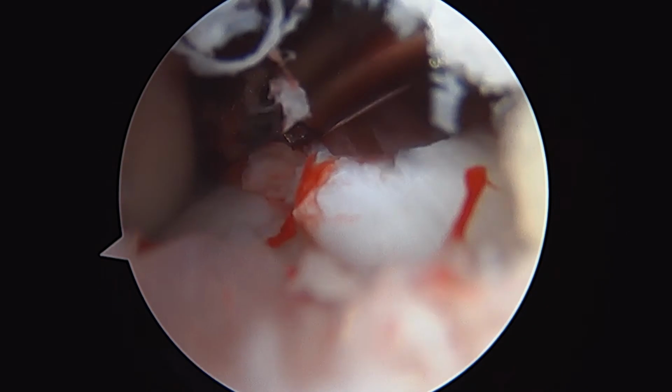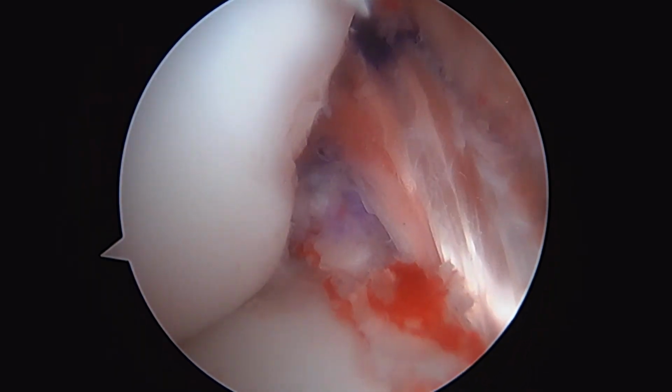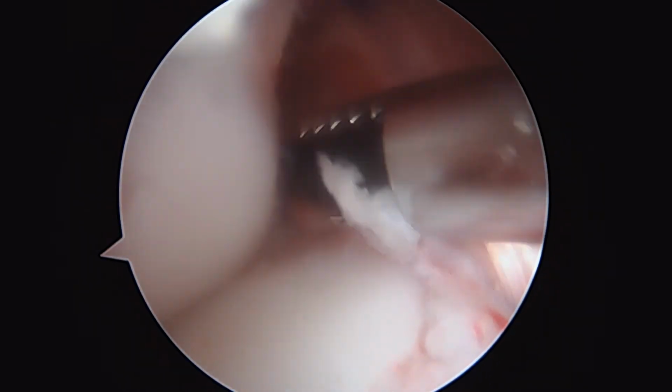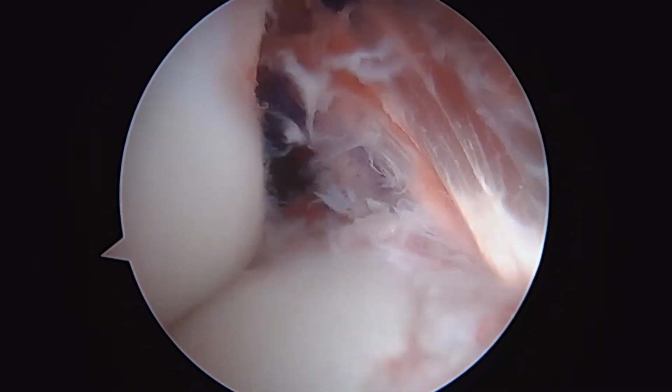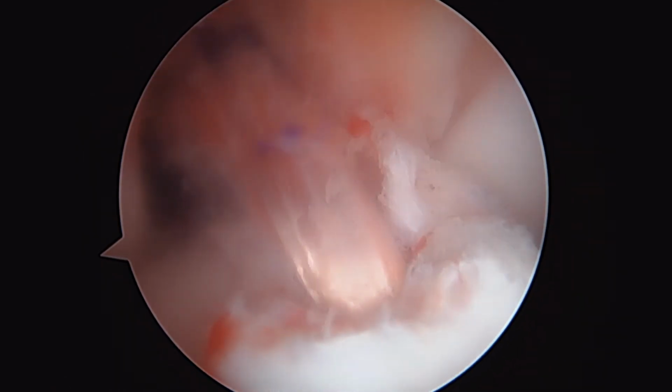I'm going to put in the shaver. Push in. Okay, I just want to make sure there's no loose pieces of anything from the tunnels that we drilled. That looks better now. All right, so we'll fix this on the tibial side, show you some more in a little bit.